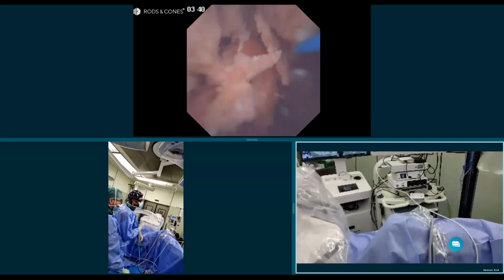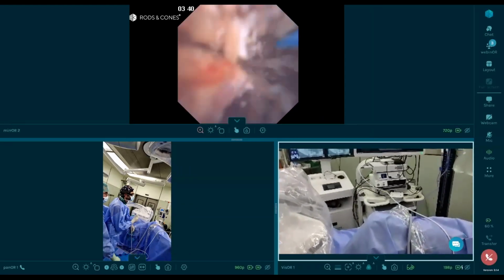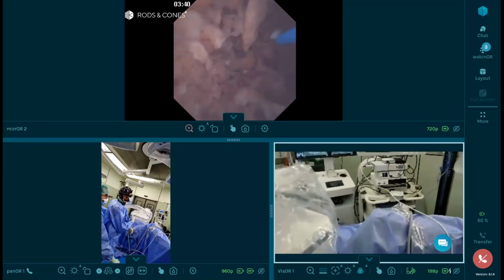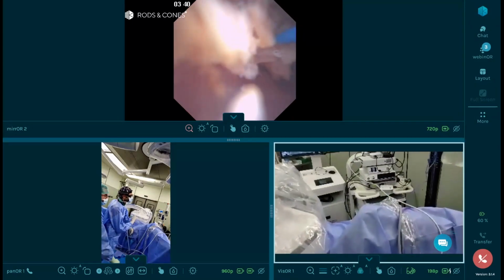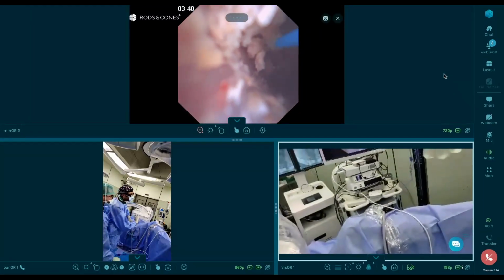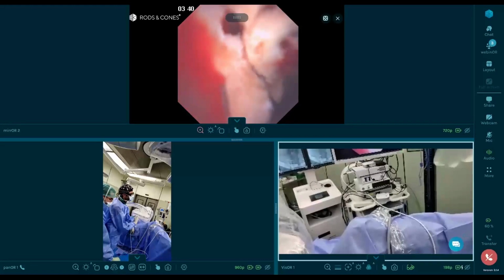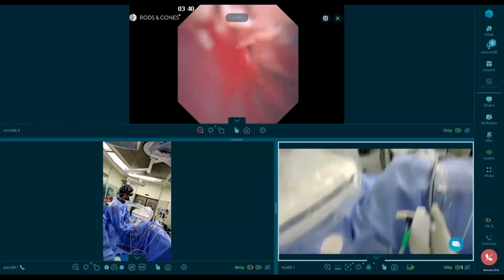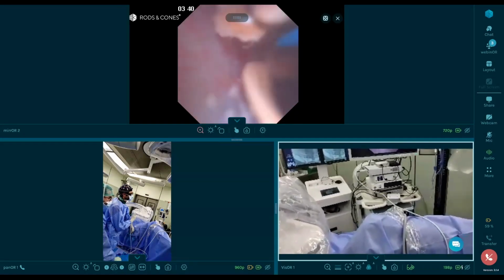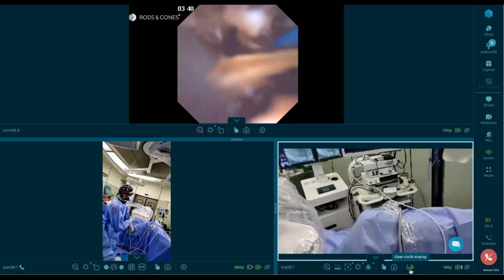We need to popcorn a little bit more, but the stones that break up very easily just need some timing. We can aspirate at some point here while we're working. I'm going to stop the irrigation and do some aspiration. ¿Me puedes subir la aspiración un poco, por favor? You can see that there's some particles coming. The irrigation is closing. They're going to increase my aspiration, so we can do it later on. But I'm going to continue to do this popcorning for the moment.